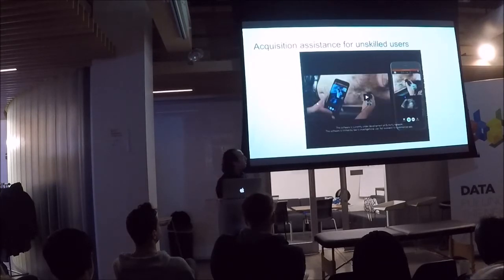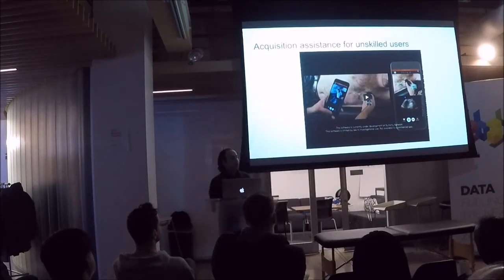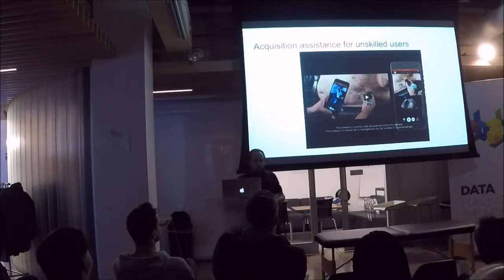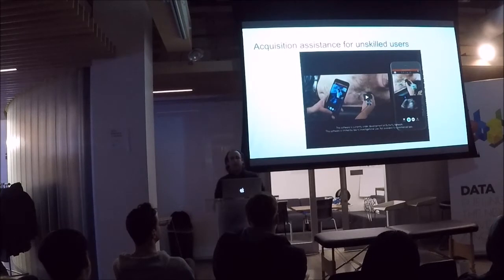One of the things that we are also working on, aside from a number of these types of automated measurements or assessments, is what we call acquisition assistance. The intuition here is that right now, if you want to use ultrasound, you have to have been trained in ultrasound for a long period of time.